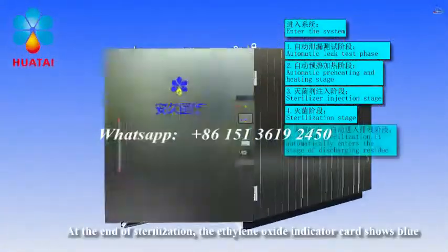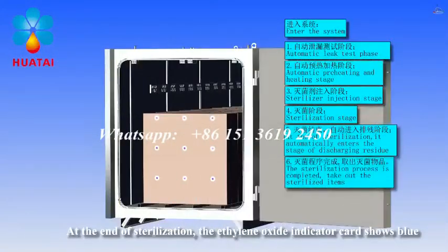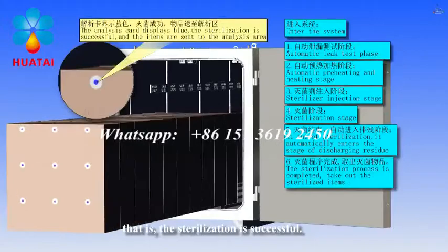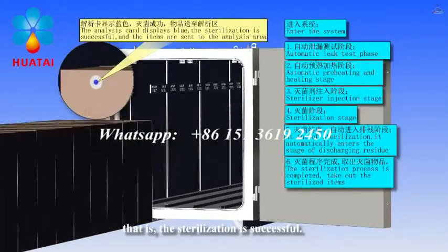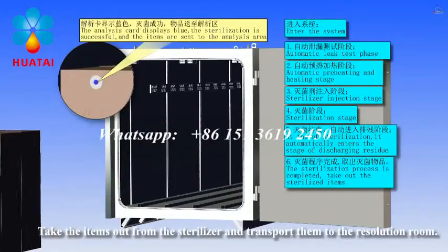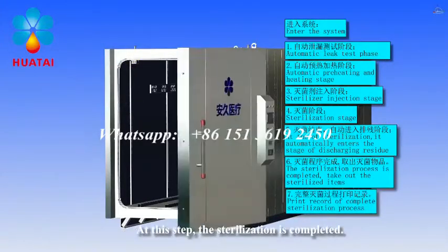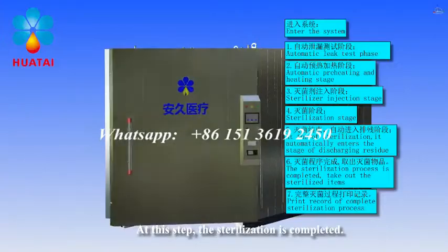At the end of sterilization, the ethylene oxide indicator card shows blue. That is, the sterilization is successful. Take the items out from the sterilizer and transport them to the resolution room. At this step, the sterilization is completed.